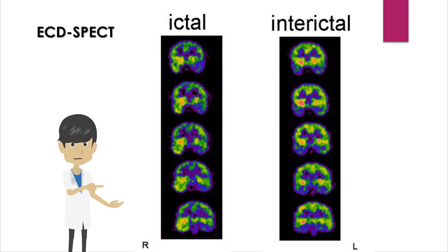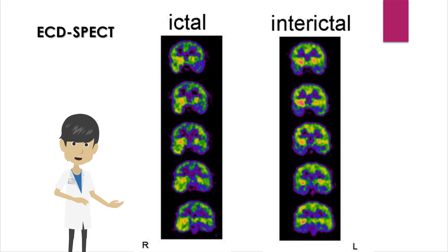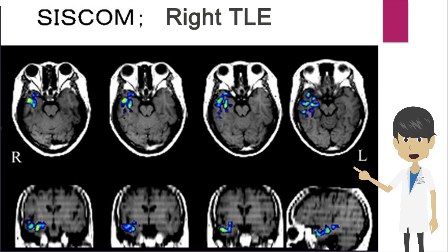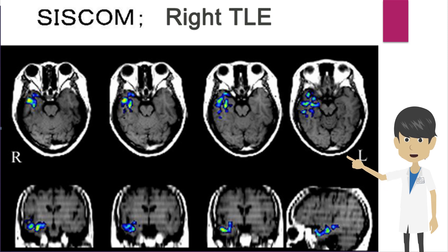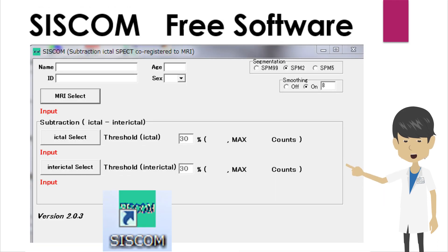This is a case of right temporal lobe epilepsy. The right temporal lobe shows decreased perfusion during the interictal phase, while showing increased perfusion during seizures. Here are the results of the SISCOM processing in this case. By superimposing the T1-weighted image, the anatomical location of the increased perfusion can be determined. SISCOM can be found in several image analysis software packages.